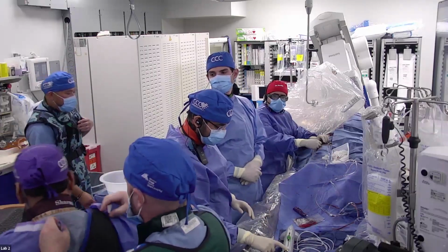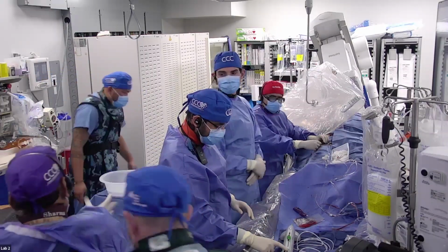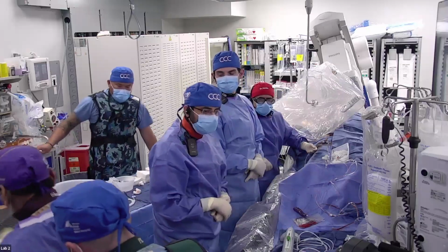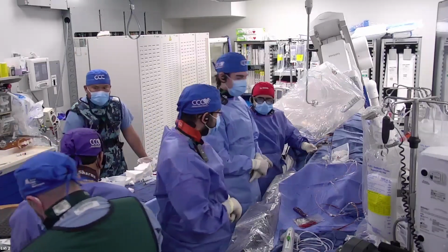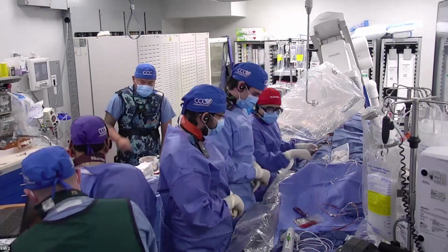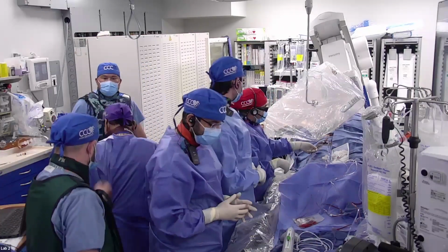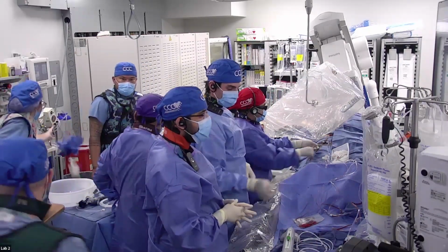We do the case presentation. So, okay. Dr. Sharma, are you ready? So let's go, we'll do 2.5, 15, we'll come back to see the side branch. Fully ready. 3.5. Yeah. Dr. Sharma, 33, right? So we can keep it provisional. We don't see you yet. We're still seeing Dr. Kinney.